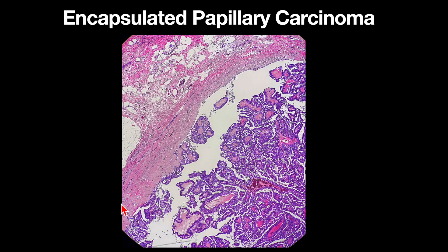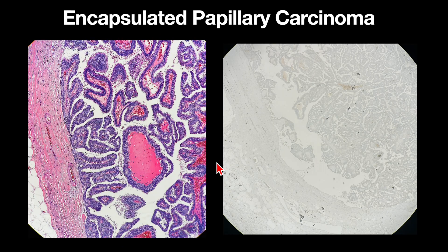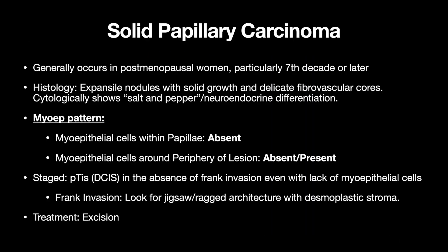Here you can see the fibrous capsule and the delicate fibrovascular stalks lined by the neoplastic epithelium. With the myoepithelial marker, it's absent within the papillae and absent around the periphery of the lesion.